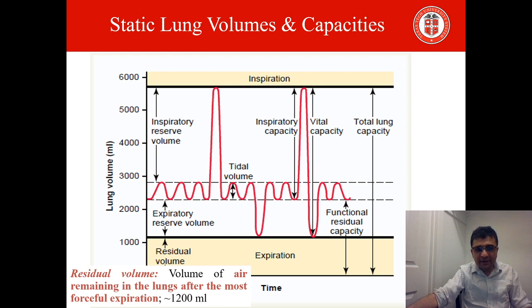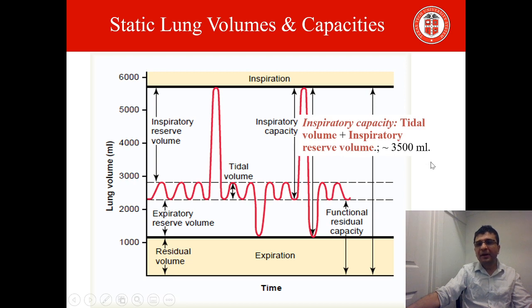And this is highlighted by this cream colored part, which says that this is the volume which will always be there in the lungs once we exhale maximally. Now, as I've been talking before, if you add volumes, it will become capacity, and the first capacity is inspiratory. So if you add tidal volume and inspiratory reserve volume, you'll get inspiratory capacity.